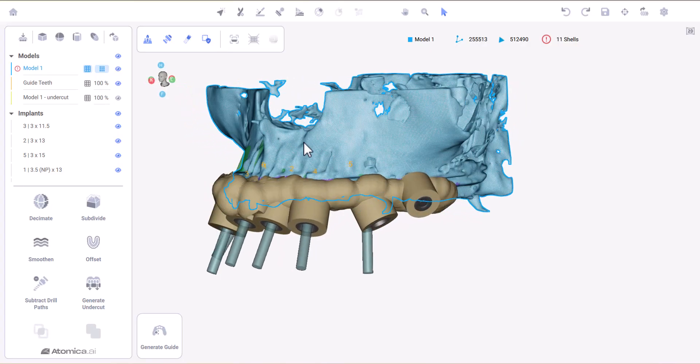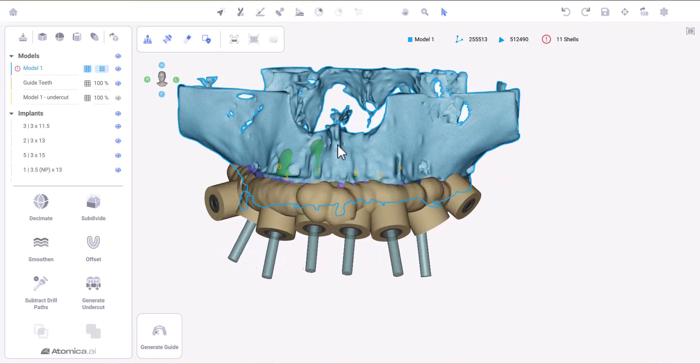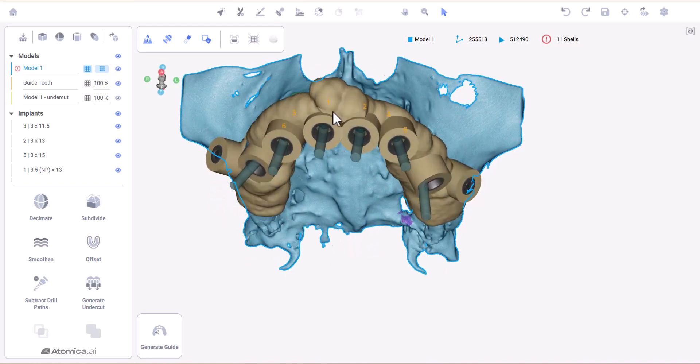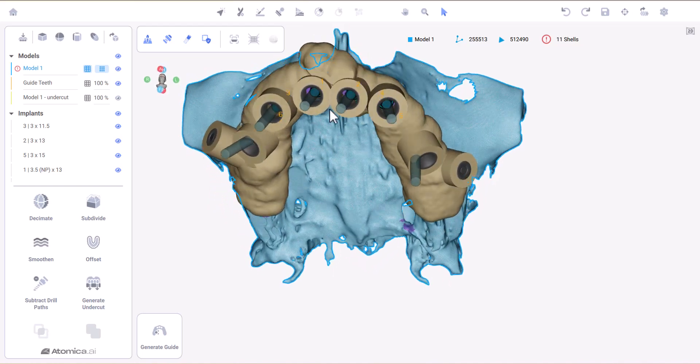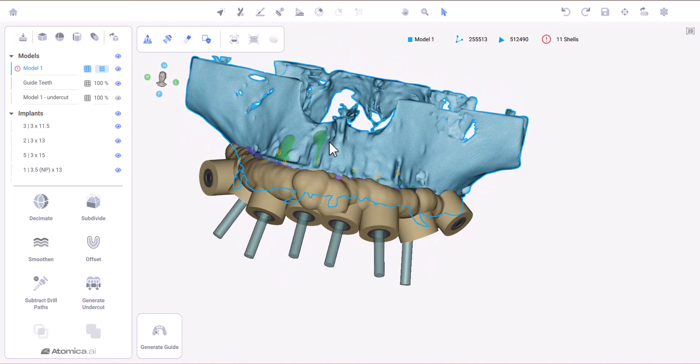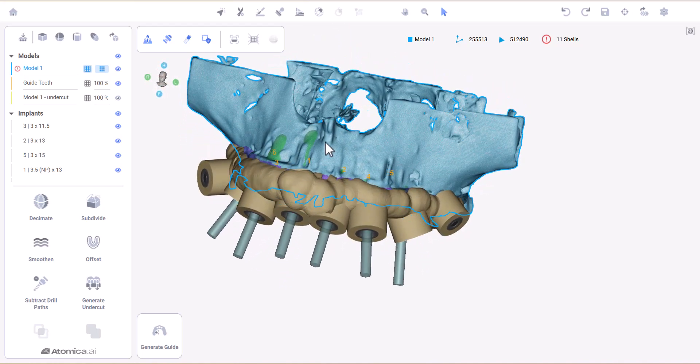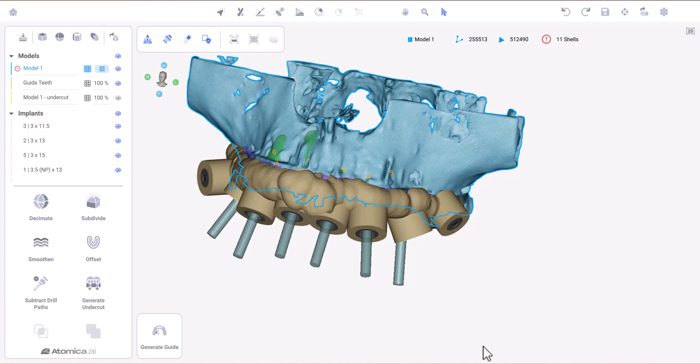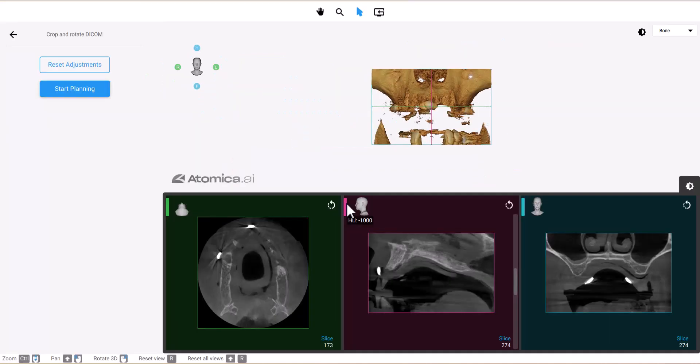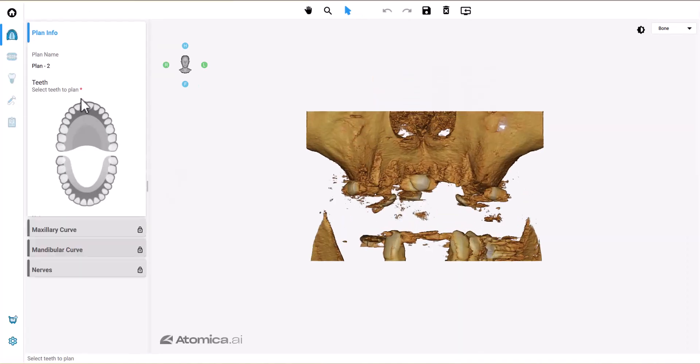Hello everyone, this is Dr. Tony, and in this video I'm going to demonstrate how to design a bone-supported guide using Atomica Guided Surgery Suite. First, I'm going to use the Planner app to plan the implant positions.